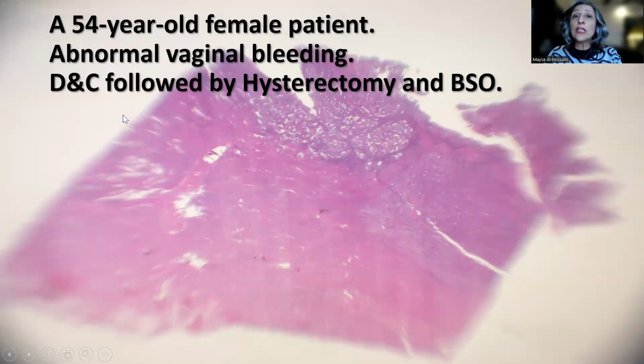I just wanted really to share with you a different example in which we would consider the ovarian tumor metastatic rather than synchronous because of the invasion and dissemination of the tumor. So similar to that case, this is a scanning power magnification of the endomyometrium.